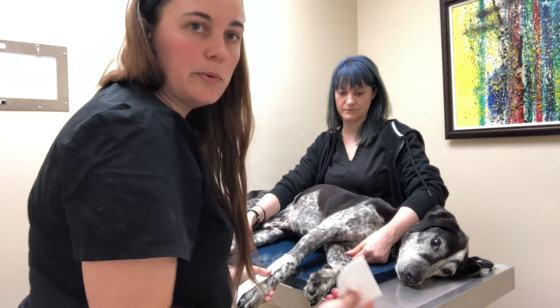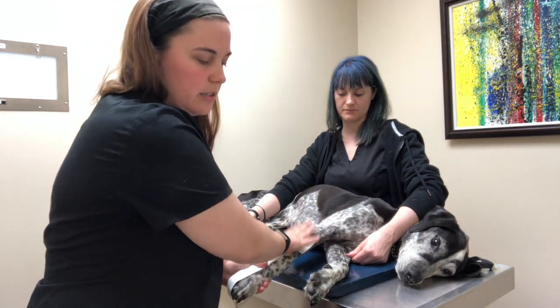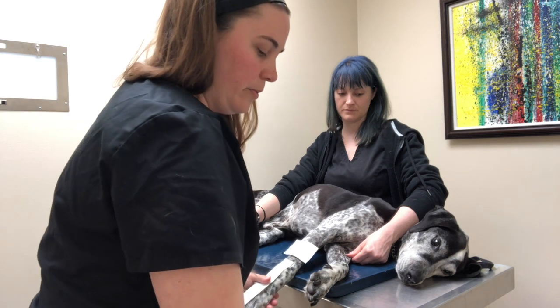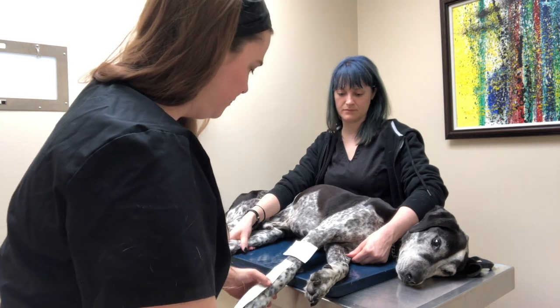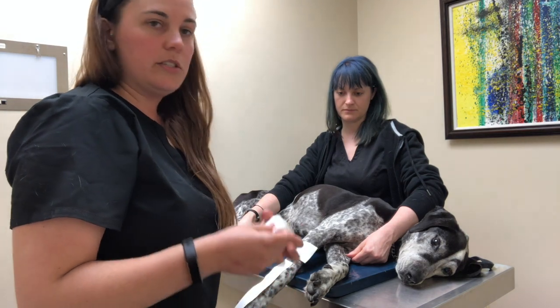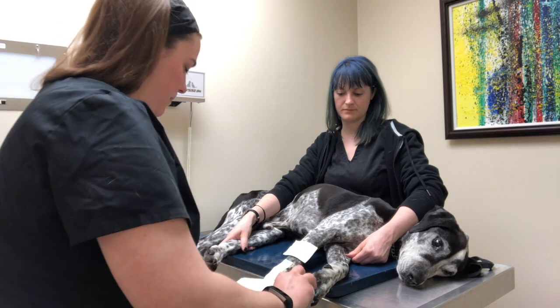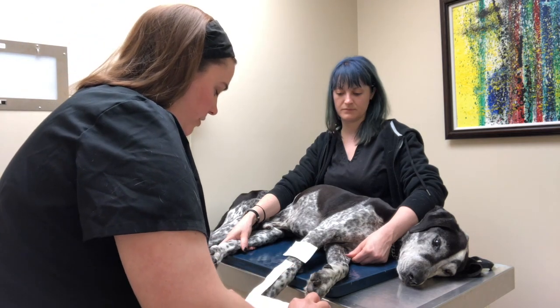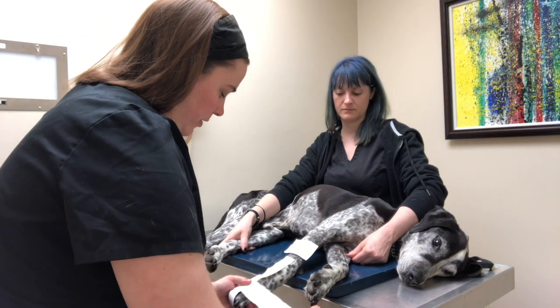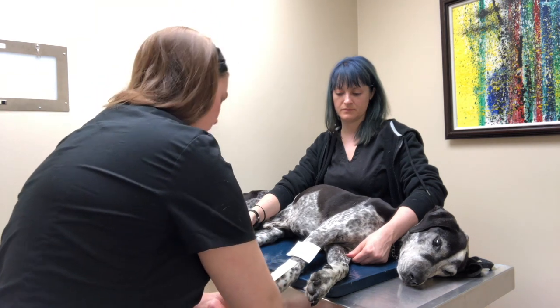And Austin doesn't have a wound, but if he did, we could place some sterile gauze on the wound itself. So the first layer of our bandage is going to be cast padding. And what we want to do, we're going to start at the distal portion of the limb, and we're going to leave the third and fourth toes out of our padding to check for swelling.